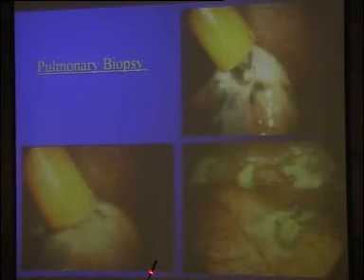It was a basic indication of thoracoscopy. A more advanced step for using thoracoscopy is pulmonary biopsy. You can see here the procedure is very simple. You absolutely need a second point of entry in this case, of course, using coagulating forceps.